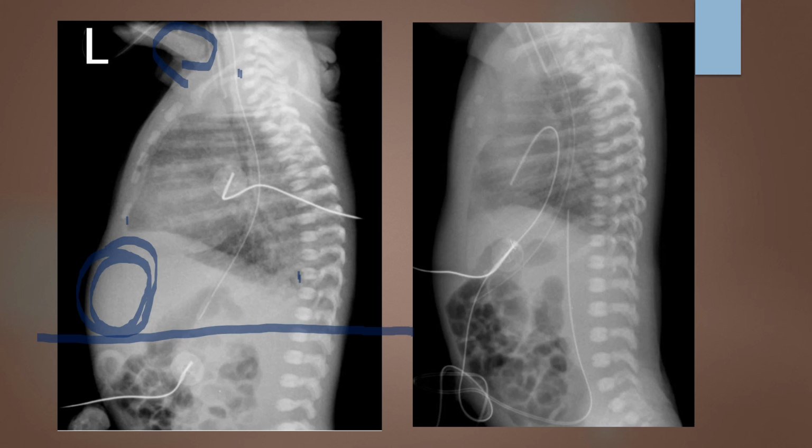So we have, if the exposure index, this would probably be repeatable based off of technique.